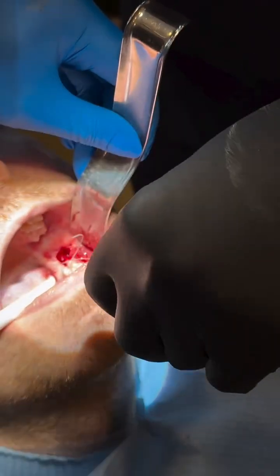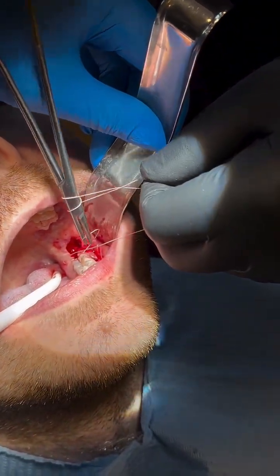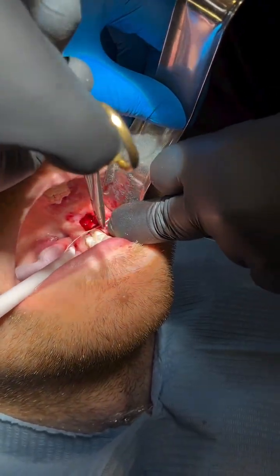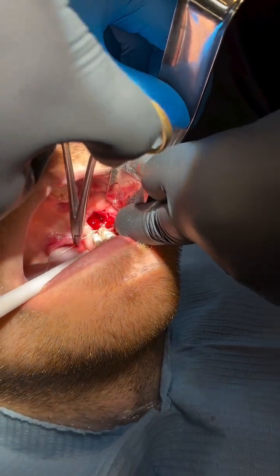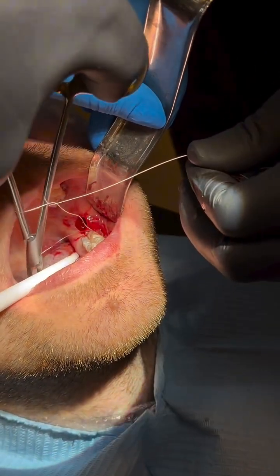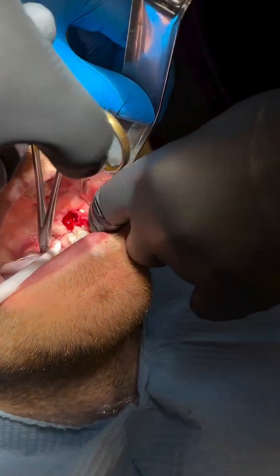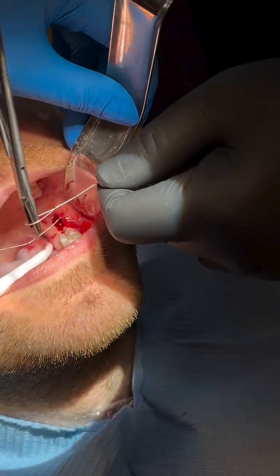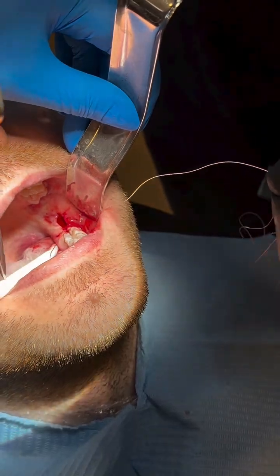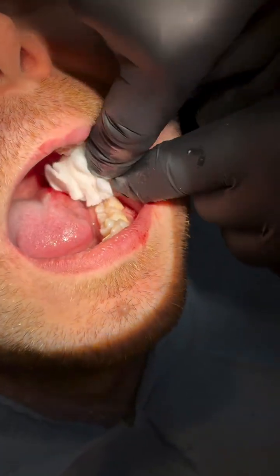I go 2 turns clockwise, hold it from the tip, and then slide. So the knot should be tight enough, but not too tight. And then I go again, just once in the opposite direction, and tie it off again. And a third one for luck, opposite to the last one. I always use 3 throws for Vicryl Rapide to secure it. And then I cut. And that's how you do it.